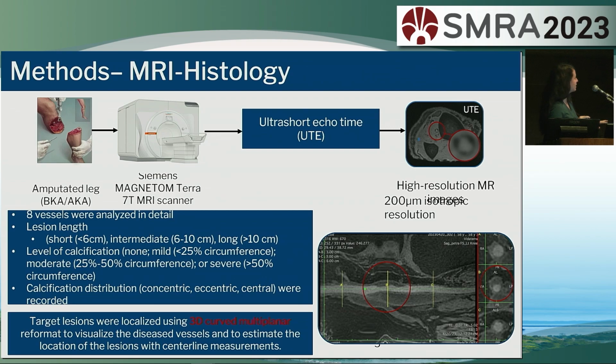We identified soft structures, like loose fibrous tissue, thrombus, fat, or microchannels, and we also identified hard structures, like calcified or dense collagen. After evaluating the MRI data sets, lesions were characterized as non-crossable if more than 50% of the lumen was occluded with calcium or dense collagen, like hard structures.